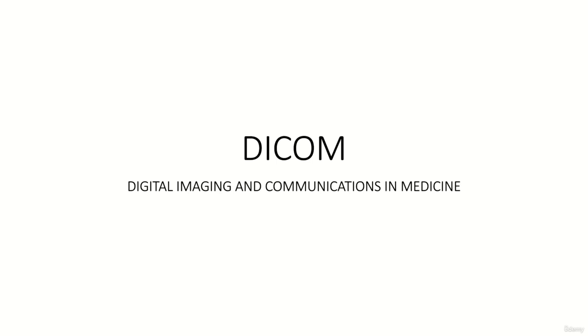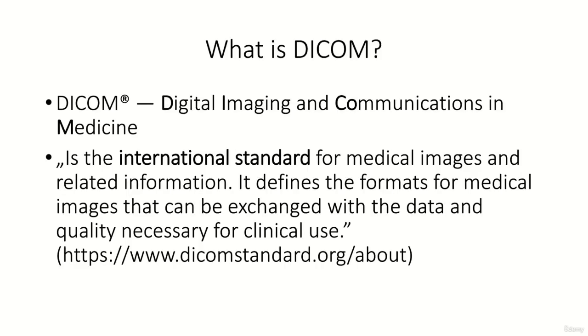In this lecture we will talk about the DICOM format. DICOM, which stands for Digital Imaging and Communication in Medicine, is, according to the official definition, the international standard for medical images and related information. It defines the formats for medical images that can be exchanged with the data and quality necessary for clinical use.